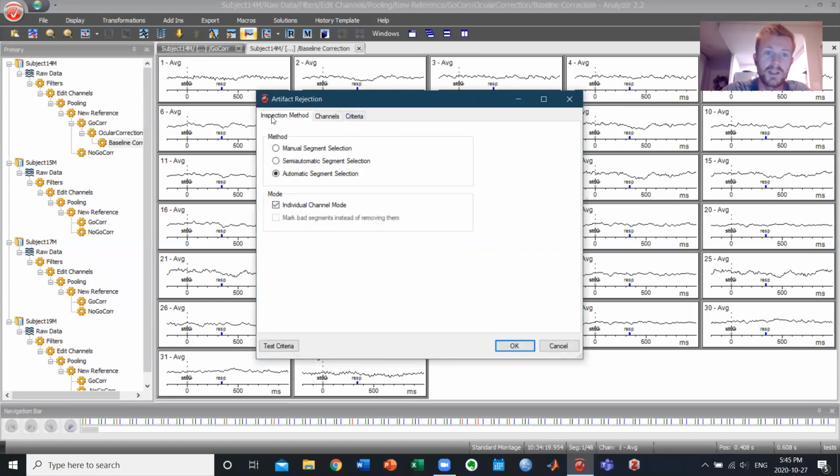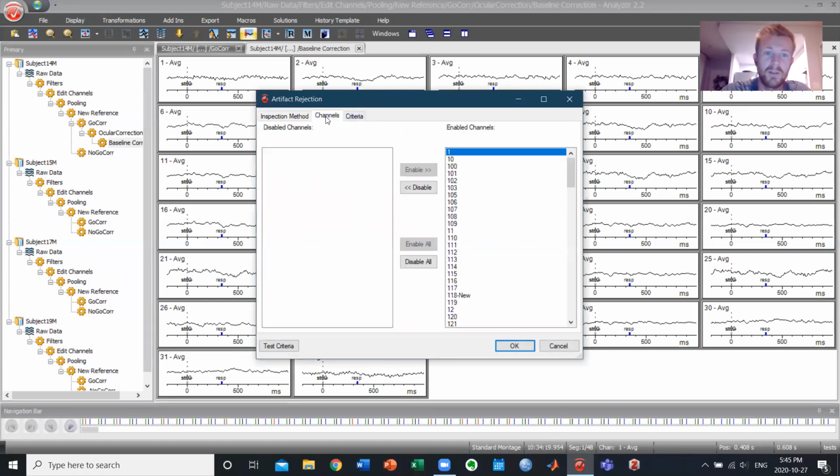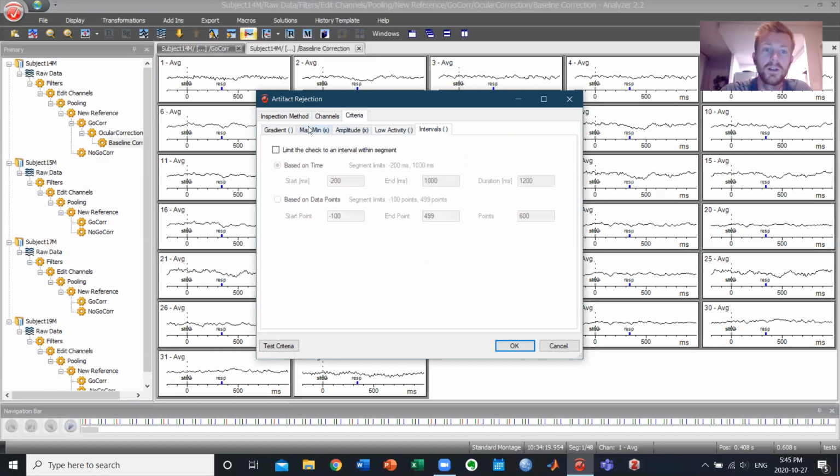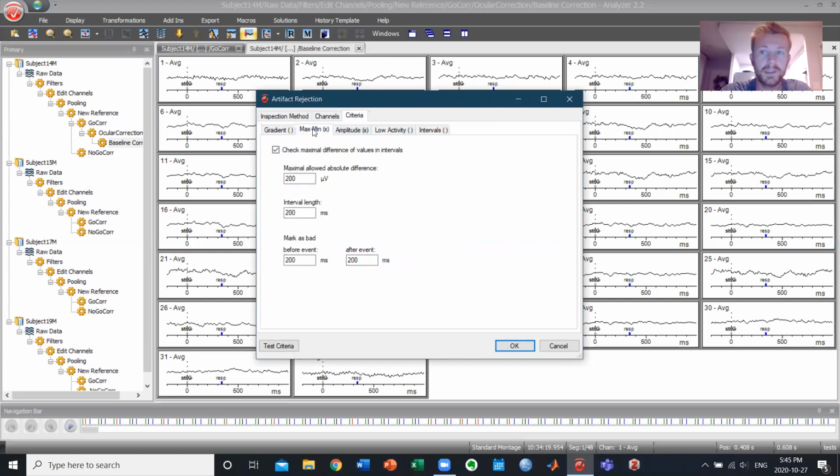So here you have three options. So those are the methods. We have all the channels that we're going to apply it to, and then we have the criteria. So there's 5 different criteria you can select. We're going to just be using 2, max, min, and amplitude. So make sure that the other 3 are all not checked on.